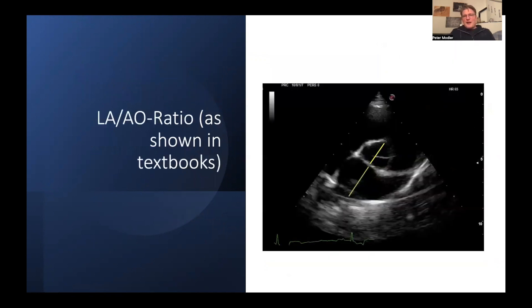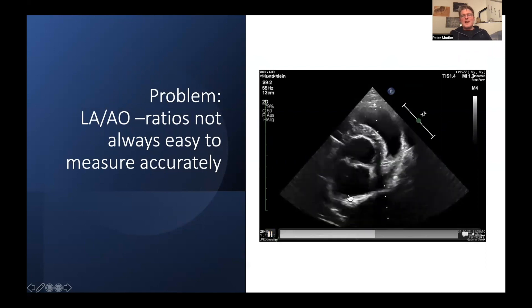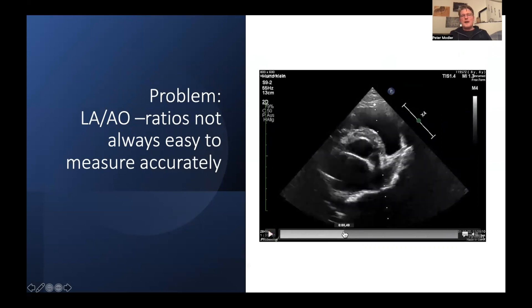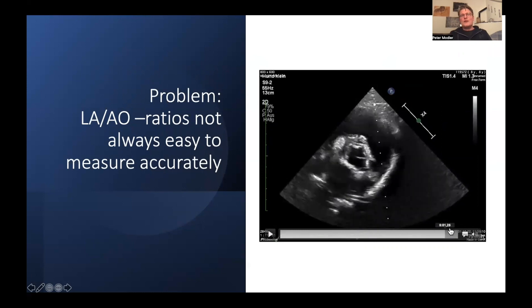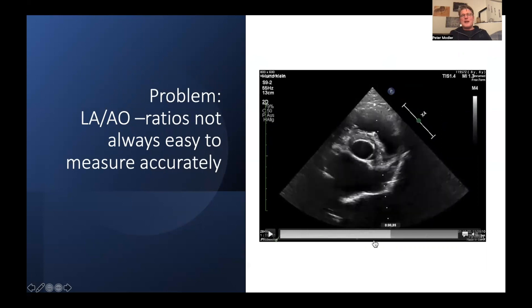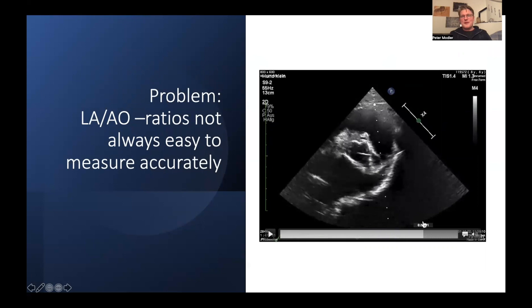If you look it up in textbooks, you will very likely find the short-axis LA:Ao ratio, where you compare the left atrial diameter to the diameter of the aortic root. Unfortunately, a view like this is not always very easy to get, so in some dogs you might get images where it will be hard to find the frame where you can really reliably assess the LA:Ao ratio correctly. This kind of view can sometimes be very challenging to get.